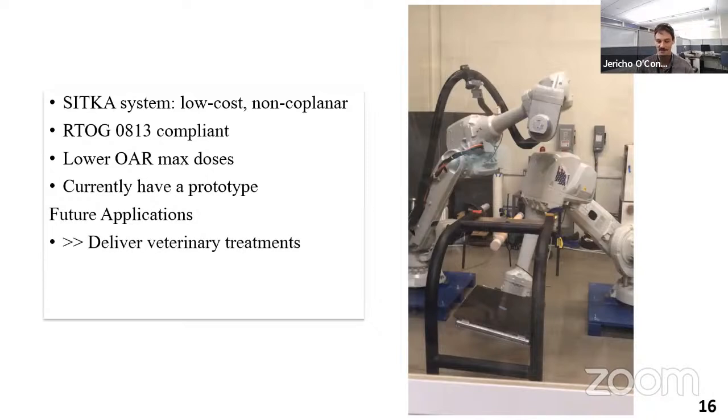which are to deliver veterinary treatments, as well as perhaps using adjuvants like gold nanoparticles in these treatments. And one of my favorite things, although we haven't done very much work on it, is contrast enhanced radiation therapy, which I think would fit in well in a low cost environment.